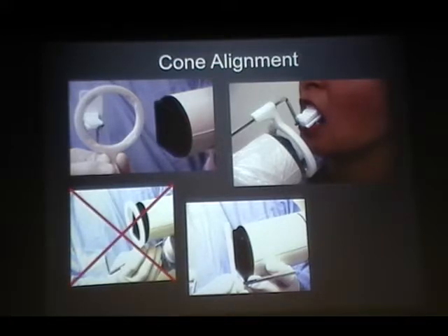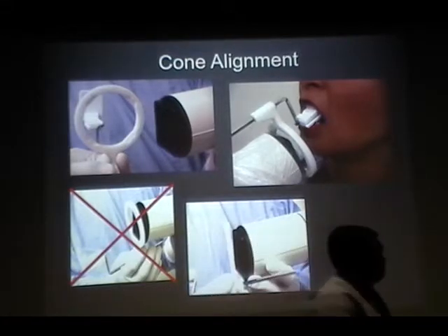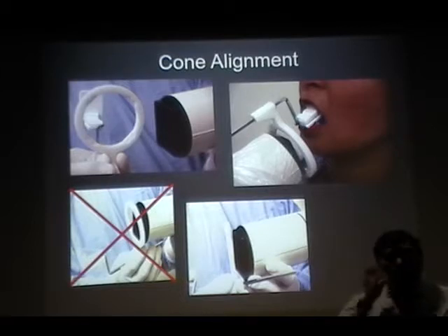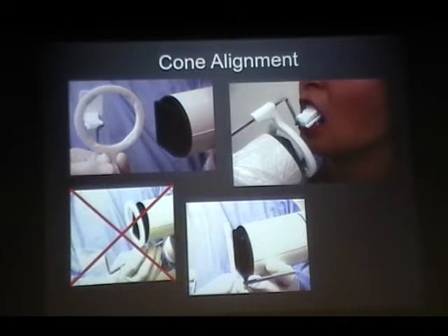So some of you guys who came last week experienced that not many people are familiar with collimator, right? So I would highly, highly recommend that when you go and practice, please ask your dental assistants to use the collimator when you're taking radiographs, because you're going to reduce the surface area and radiation to that patient drastically, almost like 50% reduction in the dose per PA.